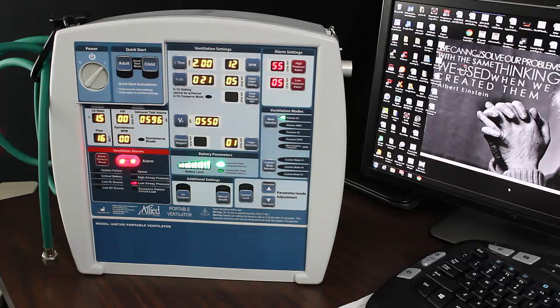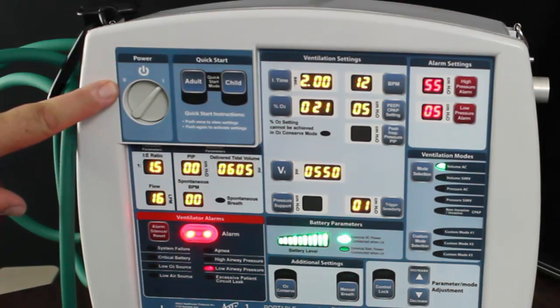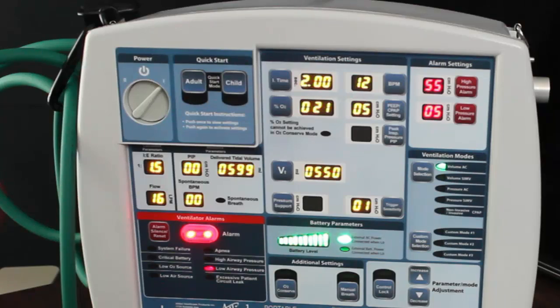This is the far-away view. This is our power — we go from zero to one. If we program the adult quick start, you hit adult for an adult, and it will give you a general set of settings.